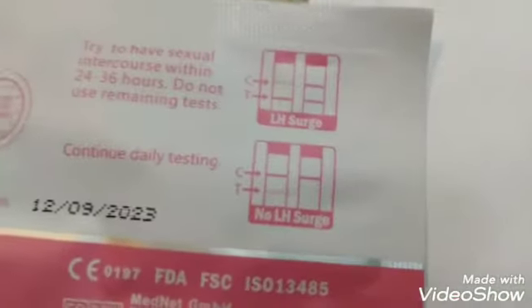Anyway, I'm going to pause this for a second because I can't use one hand to open this sucker up. But, oh, it does show you on the back about having to figure out your window for your time frame here. Where's my nail? Right there. And when you can expect to ovulate, and right here, it shows you where your surge goes away. I always test until I get equal lines or a darker test line than control, and then continue to test the next day at the same time, roughly, until it goes back to negative, because then you know your LH surge is done. And usually it's a one-day surge.